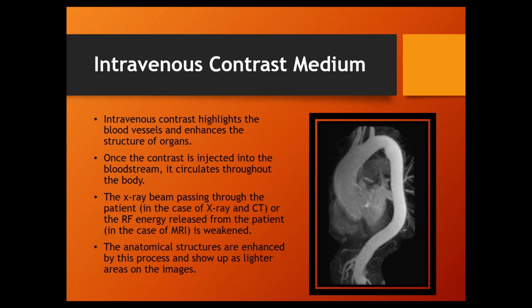works. So this is actually an image of the heart. The heart is about the size of your fist, and then this big blood vessel right here, that's the aorta. That's the main artery that comes away from the heart, and that's roughly about the width of your thumb. So you can see here, the heart in the background nearly is blacked out, almost no contrast in the heart at this particular moment. All the contrast has been pumped into the aorta.